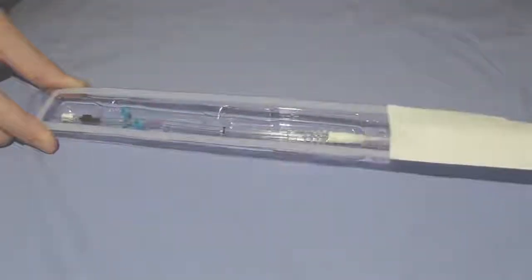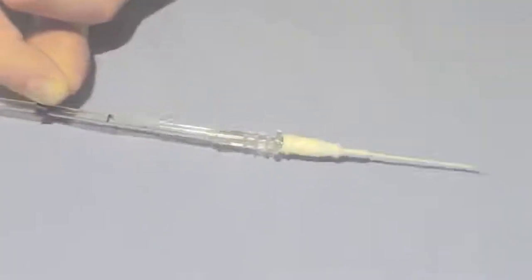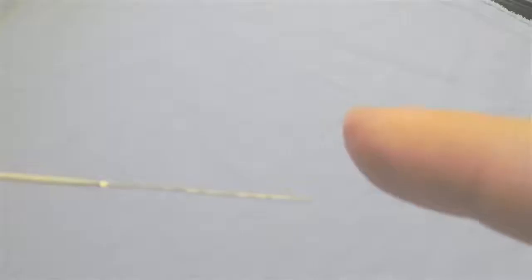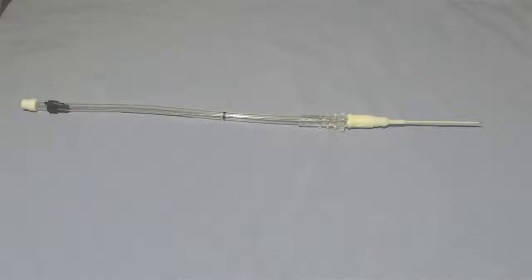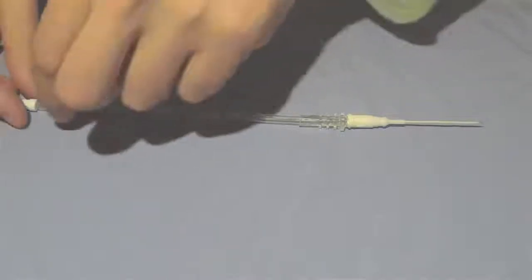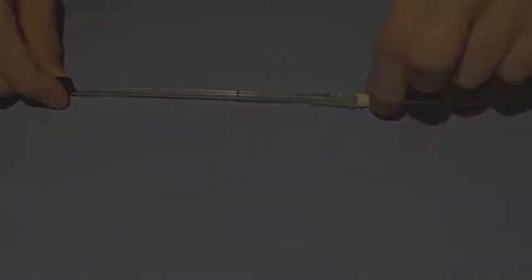The Arrow catheter kit with its self-contained guide wire is the most common needle used for arterial line cannulation at BJC. The clear plastic tubing contains the guide wire, and more importantly, allows you to see pulsatile blood flow during cannulation. The guide wire can be extended and retracted into the needle using the black plastic handle on the back. Note that the wire leaves the tip of the needle as the handle is passed beyond the black mark. There should be no resistance when extending the wire past this point.